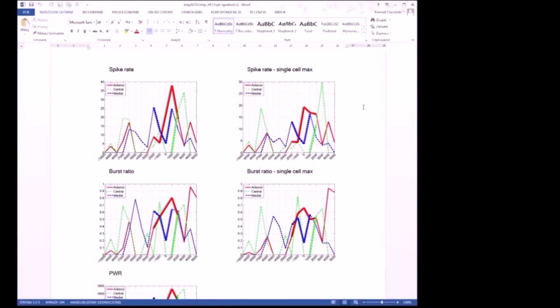There are certain areas outside of the STN that can produce a very high level of spiking activity. For example, at the negative 10,000 level, it is possible to obtain a very high level of spiking activity. This spike activity, of course, does not mean that there is part of the STN at this spot. No. It is that there are other brain structures that are also highly active. In this way, it may also cause false positive results. This is why the background attributes are much, much better than the spike-based ones.